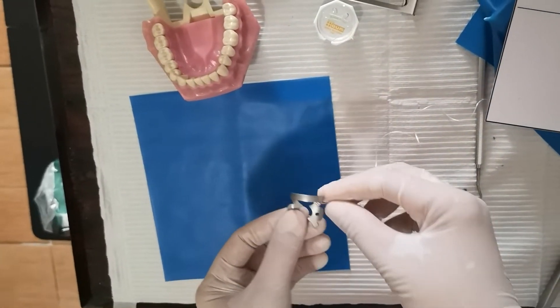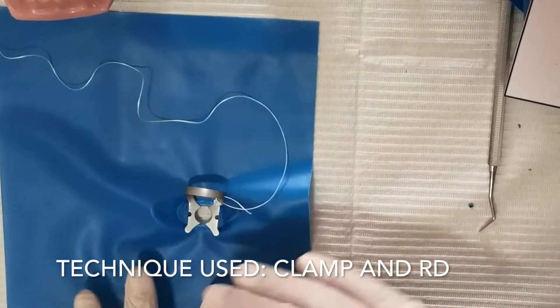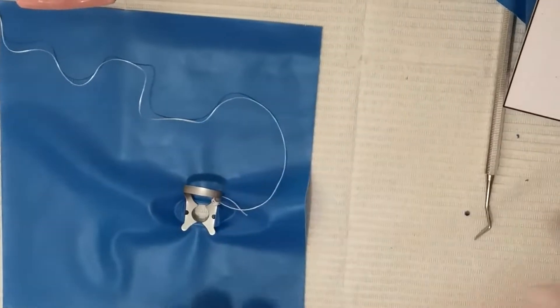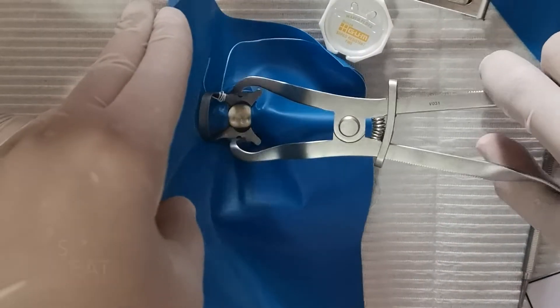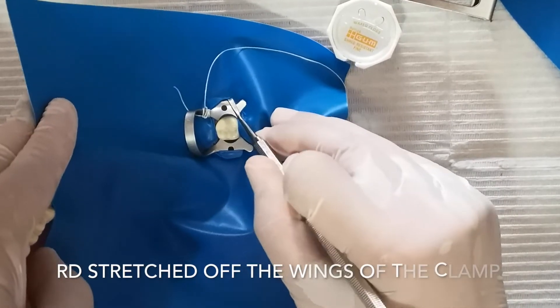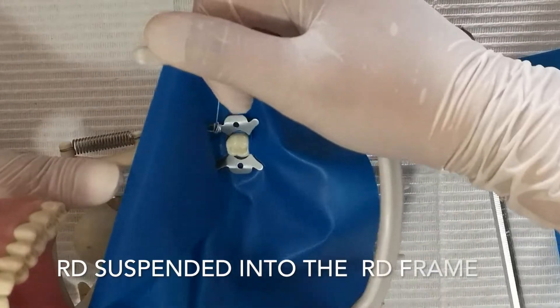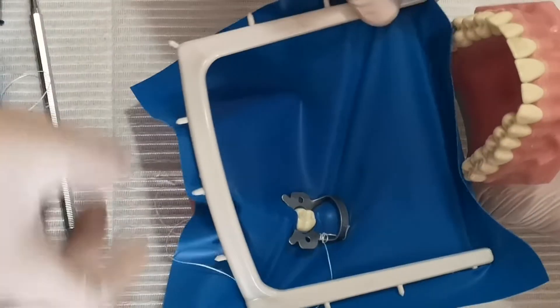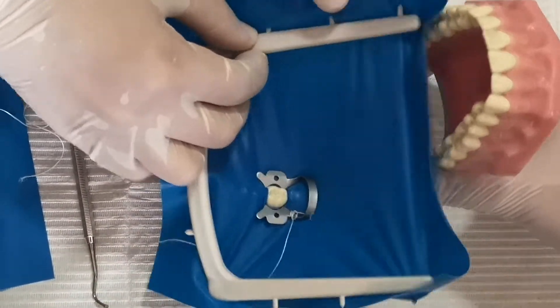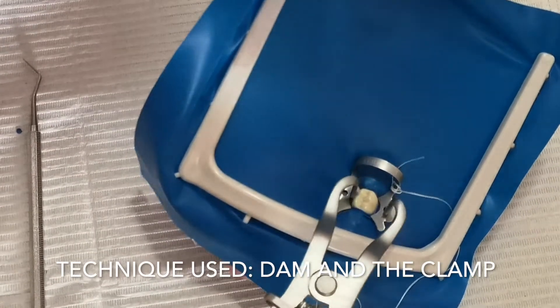Remember the bow goes to the distal. Stretch and make sure it's perpendicular to the rubber dam sheet. Hold it and then insert — buccal, then lingual. Remove and tuck it in. Attach the rubber dam frame: hook one, two, three, four, then the remaining. This technique is the clamp-with-the-dam technique.